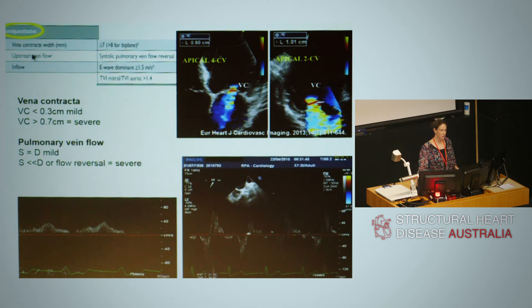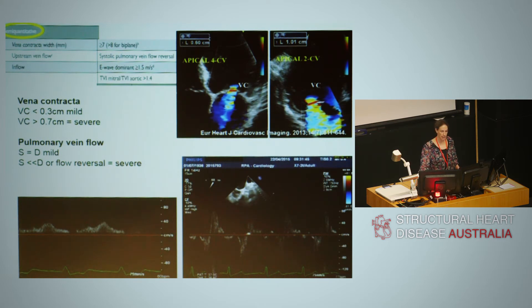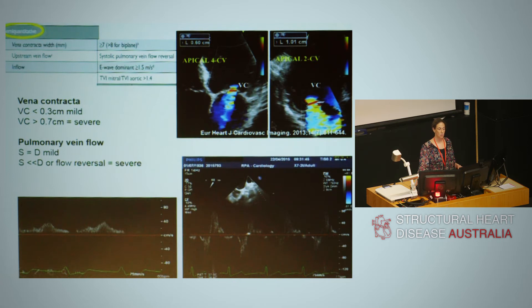Moving on to semi-quantitative parameters — the easiest to use is the vena contracta, which relies on measuring the size of the regurgitation jet at its origin. More than 7 millimetres is regarded as severe mitral regurgitation.